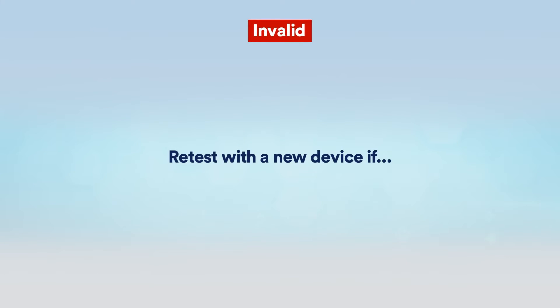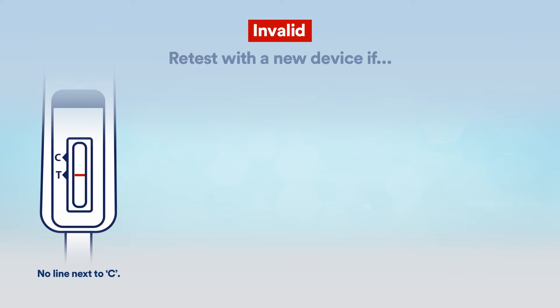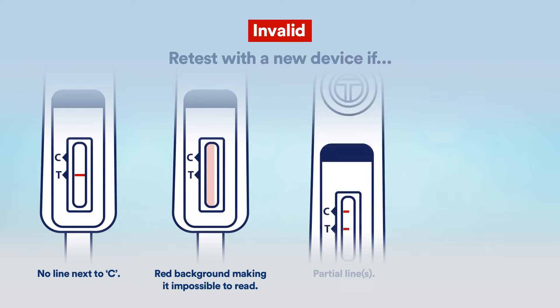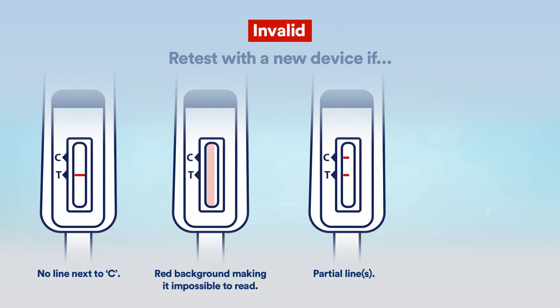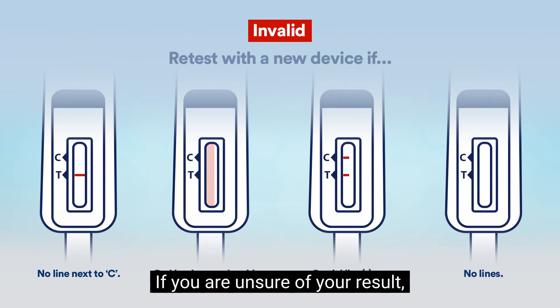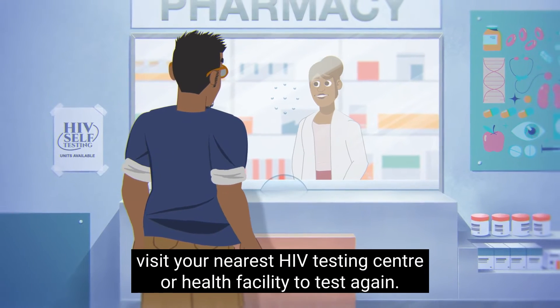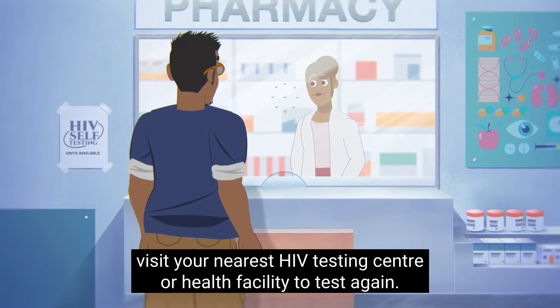Retest with a new device if there is no line next to C, a red background making it impossible to read, a partial line or lines, or no lines at all. If you are unsure of your result, visit your nearest HIV testing center or health facility to test again.